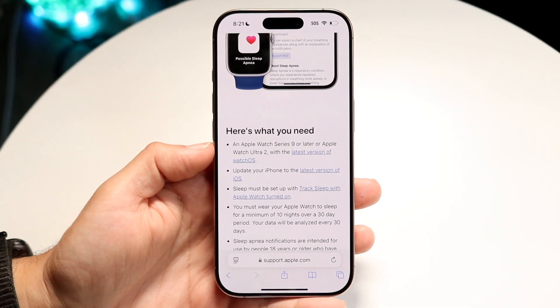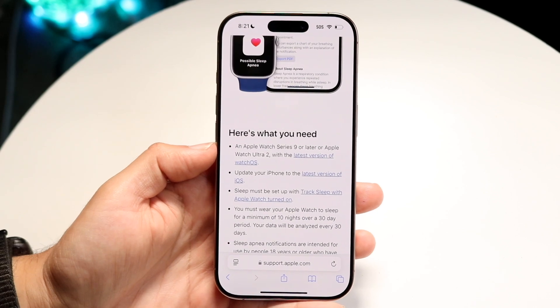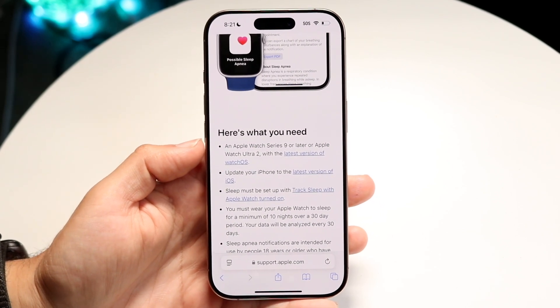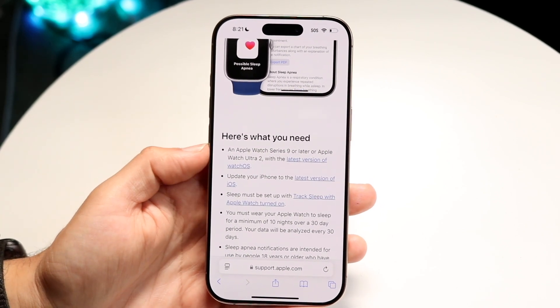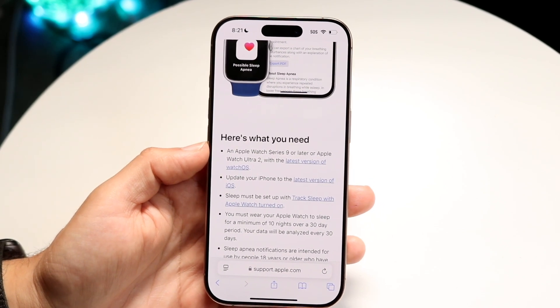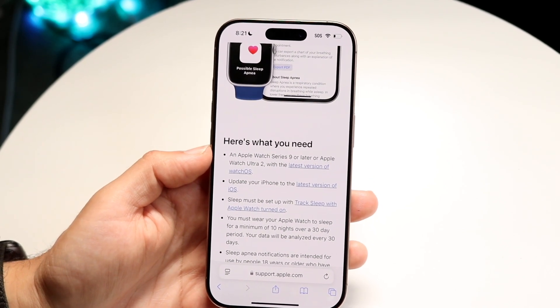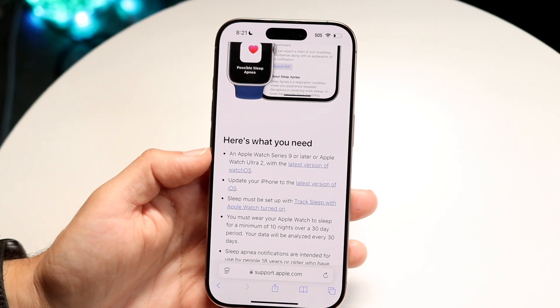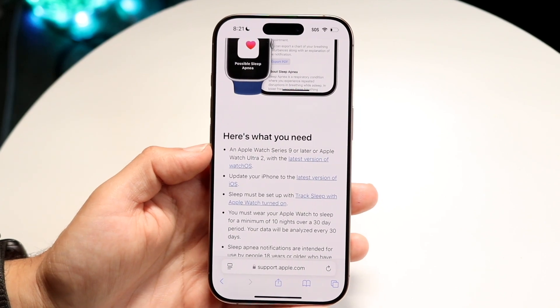Make sure you have either one of those — an Apple Watch Series 9 or above, or an Apple Watch Ultra 2 or above — otherwise that's going to be a problem.